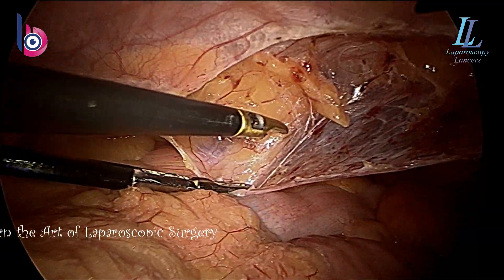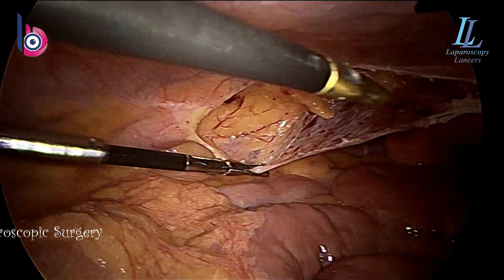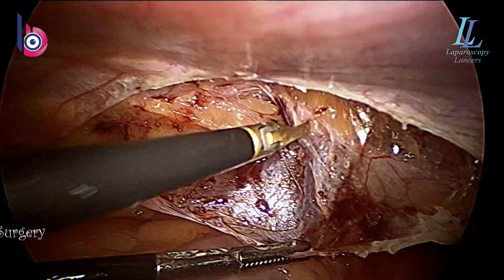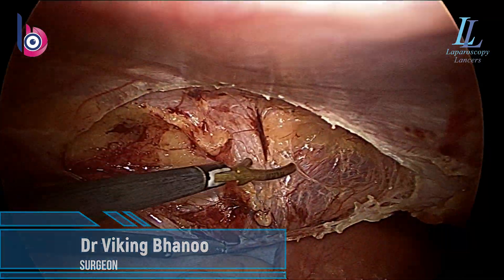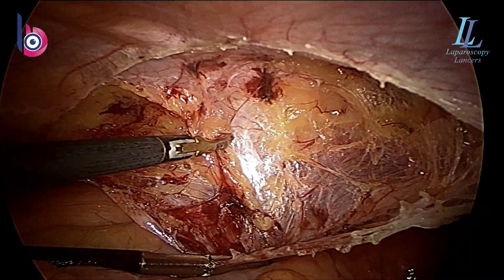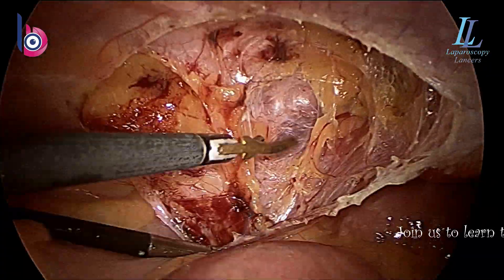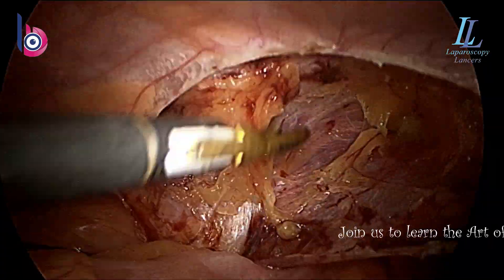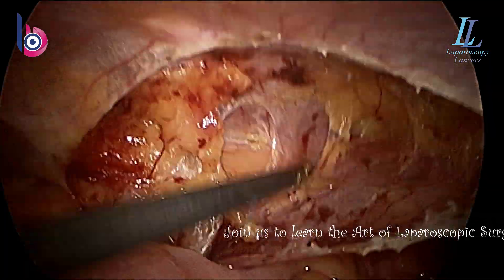It actually doesn't really matter how much the pressure is — the space there is adequate. We are doing an ipsilateral TAPP for left-sided inguinal hernia. You can see the advantage: the camera is on one side and the ergonomics are so good that your shoulders will never get tired. Earlier I used to do TAPP with ports on both sides of the abdomen, and that was very difficult — the shoulders would hurt.